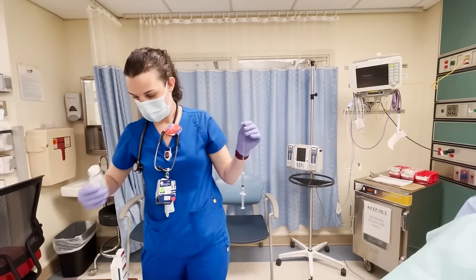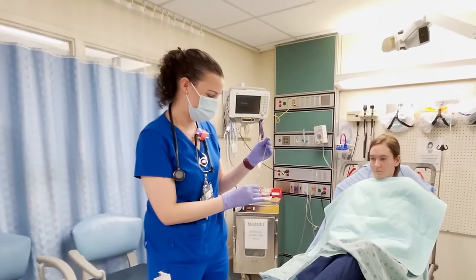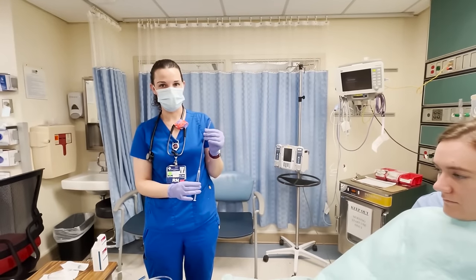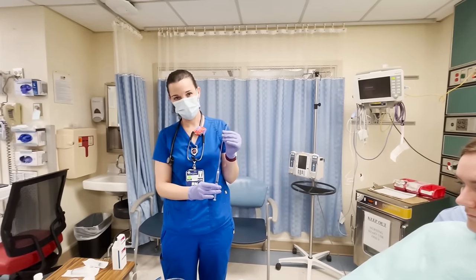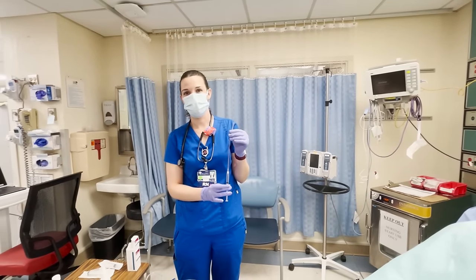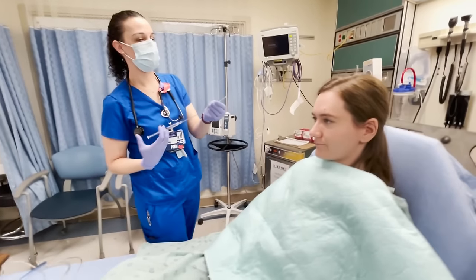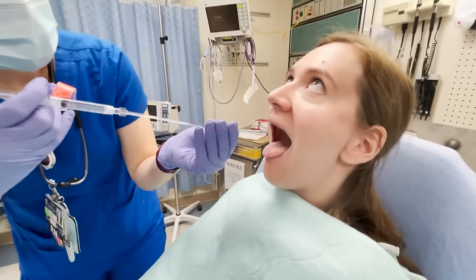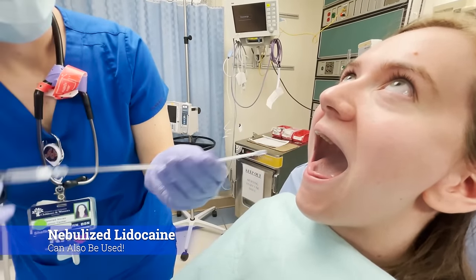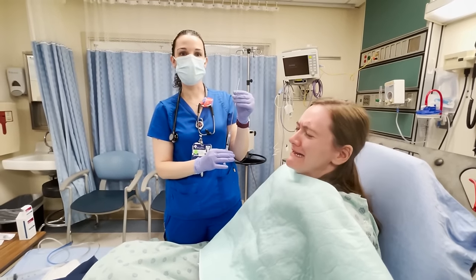What do you think the max lidocaine dose is for an adult? It's 300 milligrams — that's the recommended max. For a kid it's 4.5 milligrams per kilogram. This is a 4% solution, which has 40 milligrams per ml. Then you still calculate the 2% lidocaine jelly, which has 20 milligrams per ml — and you can swallow about 10 ml of that.